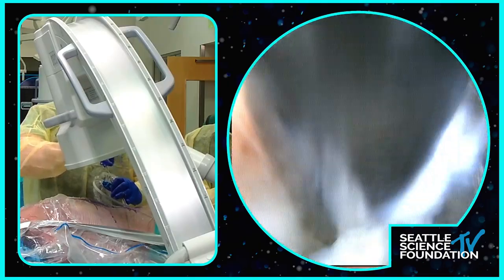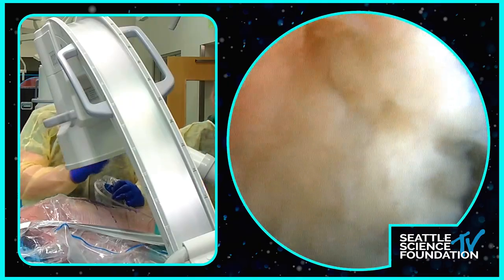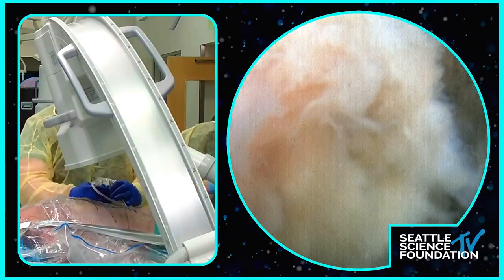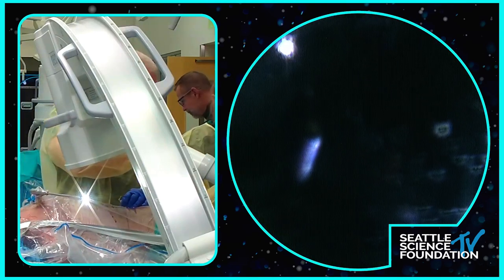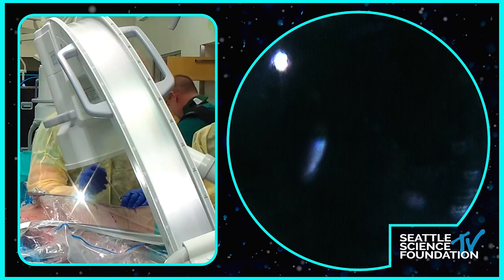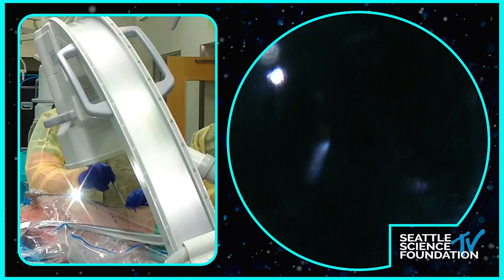Hey, Ray, we have to move on because lab starts at 5 p.m., and I think nobody wants to give up any of the precious lab time. So in terms of discectomy right now, you can probably play there for another couple hours to dig out all this stuff. Do you want to just quickly put the cage in and sort of show us that? Yeah. Right. So we'll do the one step. And then I switch over to the system.